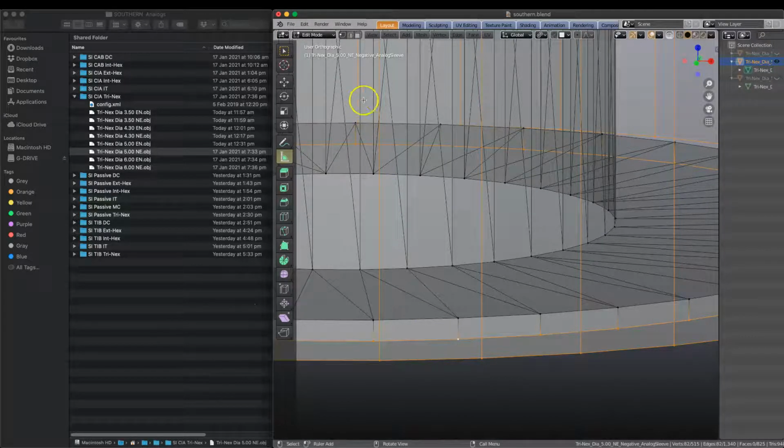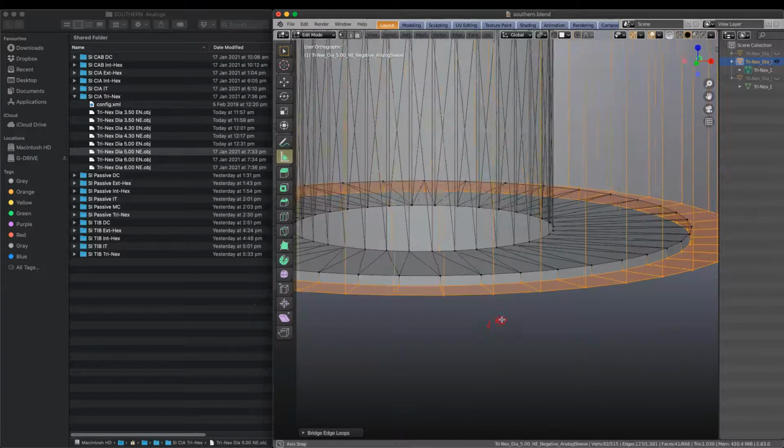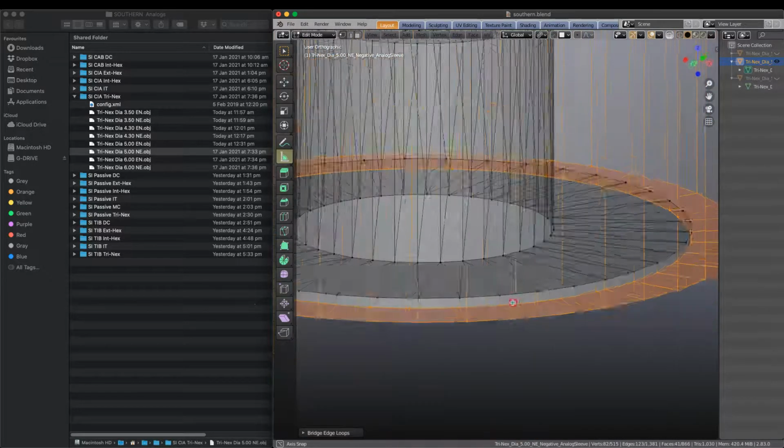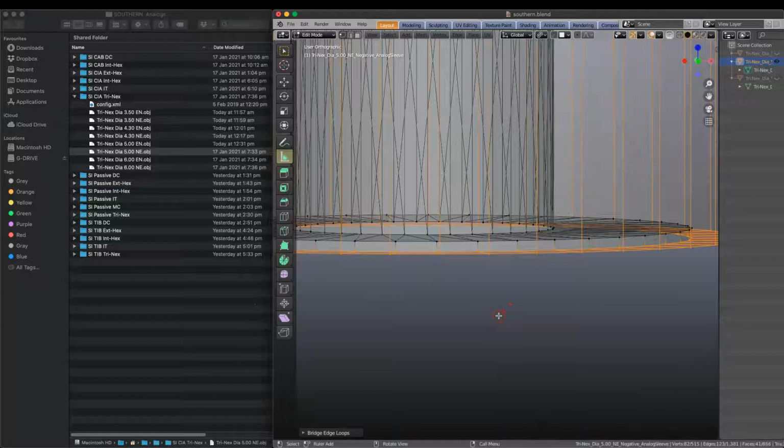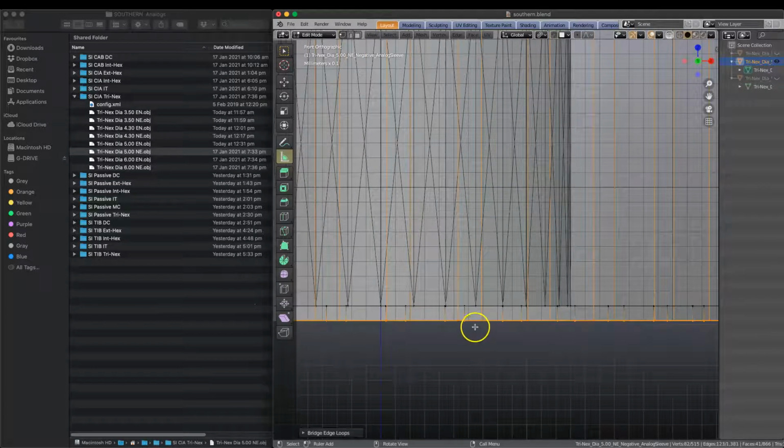I'm going to go up into Edge and choose Bridge Edge Loops. Okay, that joins the two. So you can sort of see what we're doing here. Next thing, keep those vertices selected. This is very important. Tilde key, front. Okay, now we don't know which one of these edge loops lies higher up on the Z axis than the other, which means that our cutting tool will not be able to select the correct surface.